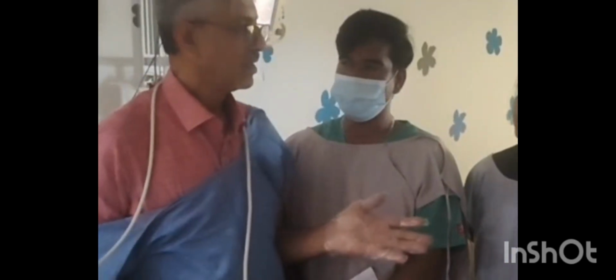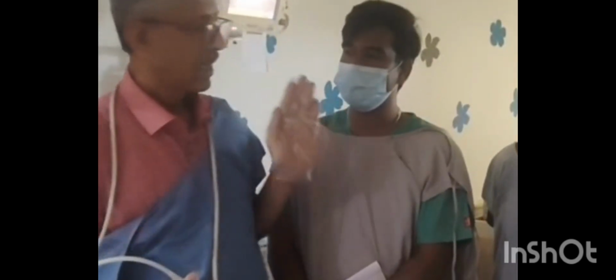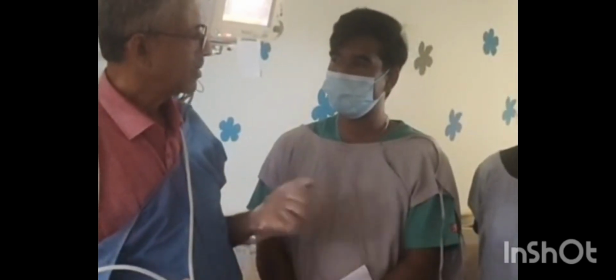Anything you want to ask me? So we understood that the right coronary artery and left coronary artery are dilated. My friend asked what? So we are suspecting a case of MIS-N. So why did you suspect MIS-N?